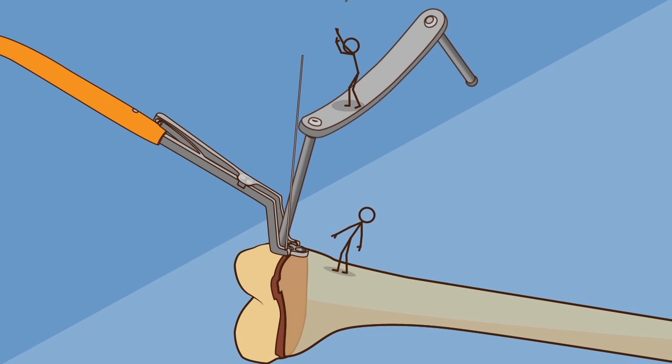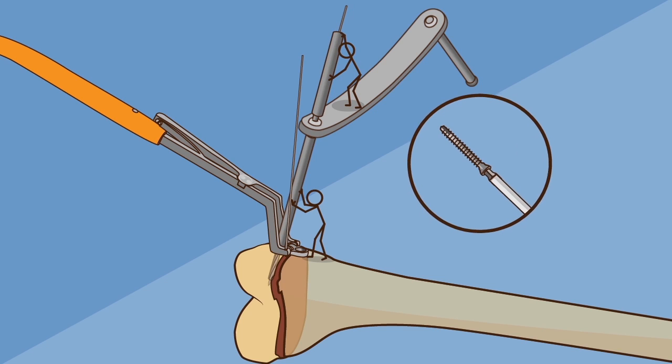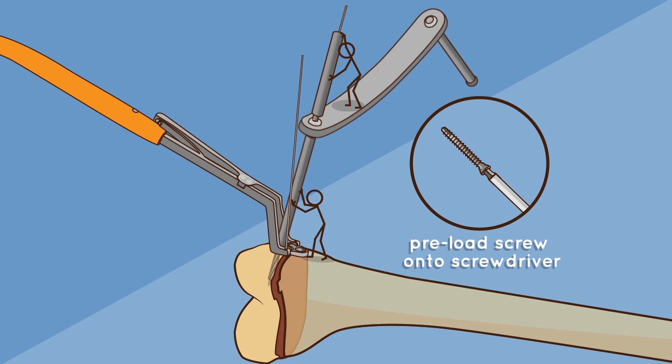First hole preparation: using the dual guide, insert the first wire into the epiphysis while maintaining pressure with the dual guide to ensure bone contact. Drill over the wire, note the screw length required, and preload the screw onto the screwdriver.